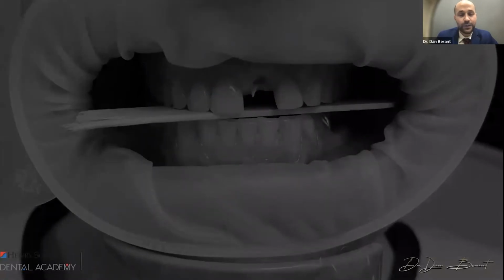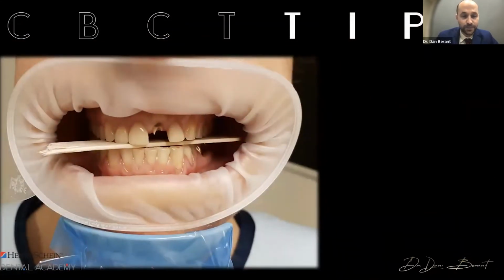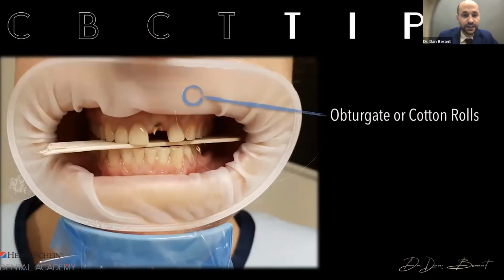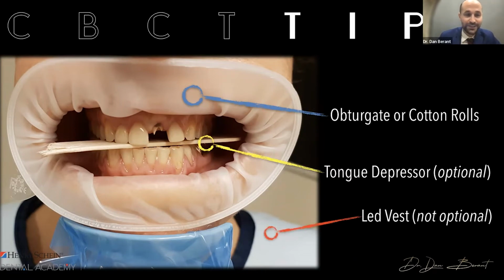And so let's give a few tips on taking a CBCT. I like to use an Optragate or a cotton roll inside the sulcus. That helps to separate the cheek and better visualize the area that we're working in. A tongue depressor allows the ability to, again, visualize and plan the prosthetic. And then the non-negotiable is always safety first and using a lead vest.